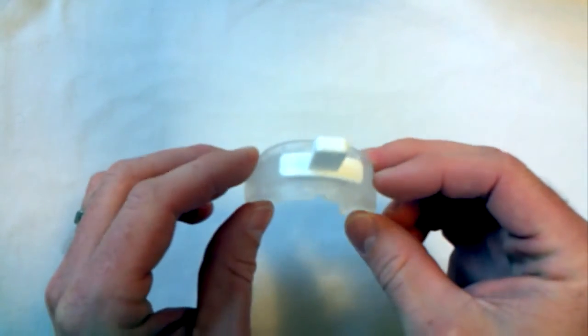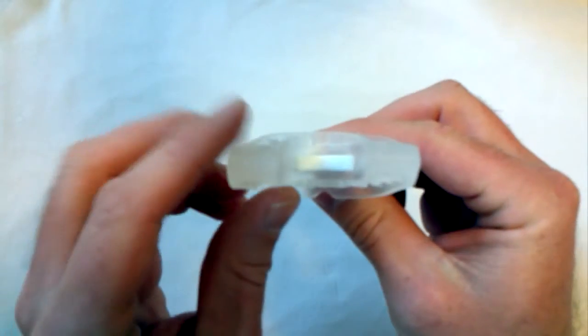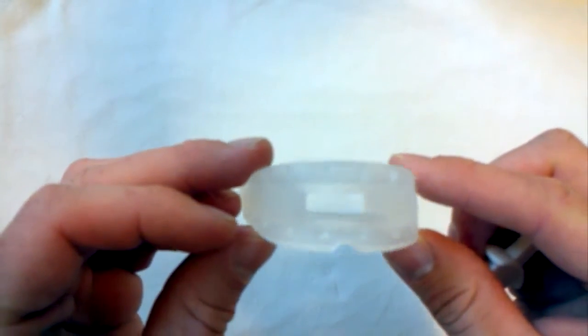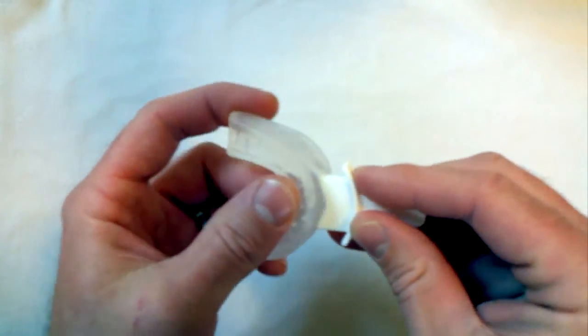And it looks like it's a boil and bite style mandibular advancement device with a breather hole. Take out this spacer here for a second so you can see it has a fairly large breather hole in the front, as you can see here. That's definitely a good thing if you're a mouth breather. I'll go ahead and pop this thing back in.